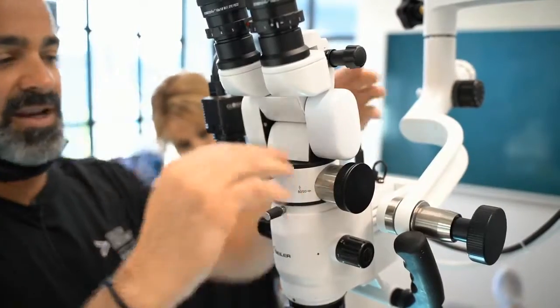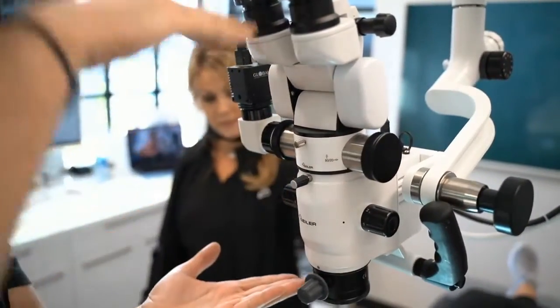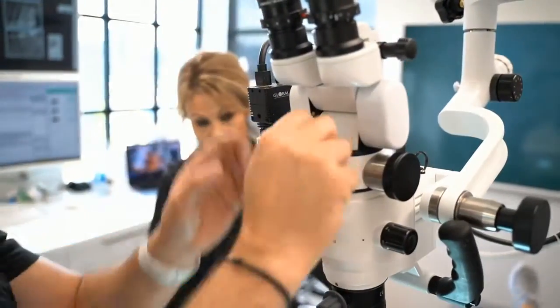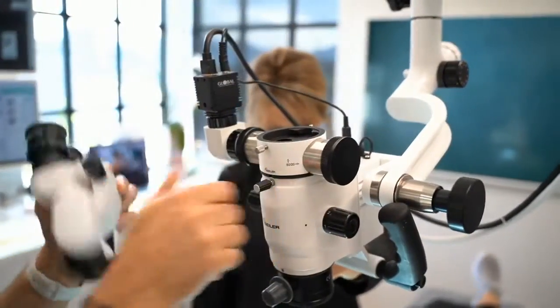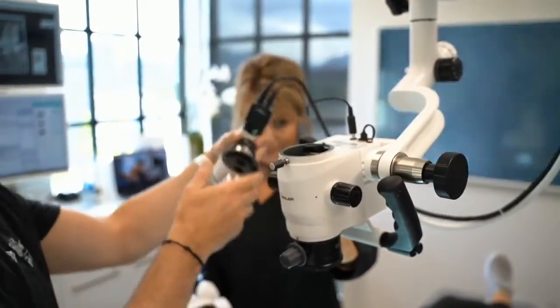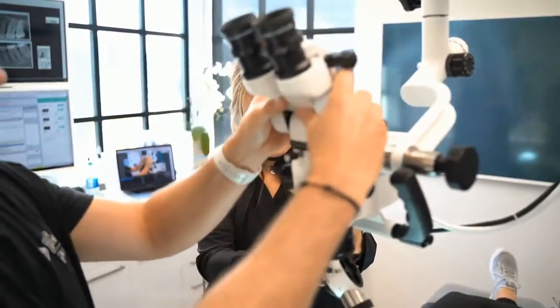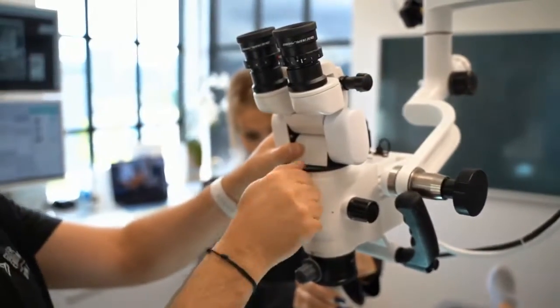It's kind of nice to shrink this distance up. As you start stacking these parts, this scope gets taller and taller. And if I were to take this beam splitter off, you can see how small that would get here. You want to hold this for a second? If I were to take this beam splitter off and put this on, which is how the scopes really come given to you, it'd be something like this.